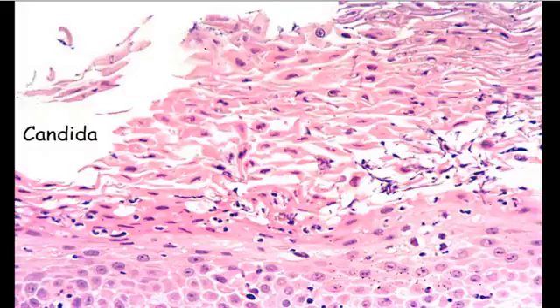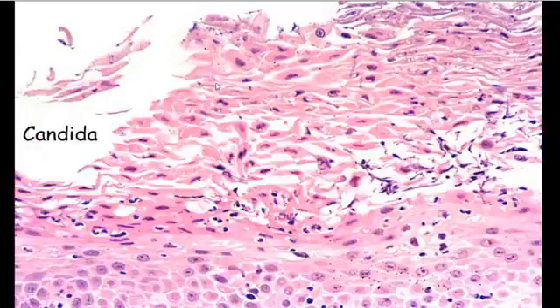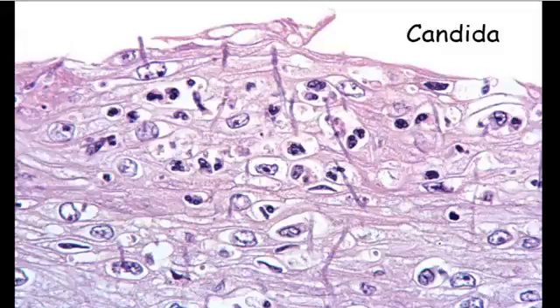And here's the kind of thing, these epithelial cells are sloughing off, and maybe in the front row you can see there's a couple of hyphae growing sort of perpendicular to the axis of the squames, and whoa, down below a couple of neutrophils to tip you off that, hey, maybe you should look here. Here's one where you can really see them. Most of the time on a good H&E you can identify these without having to get a fungal stain.